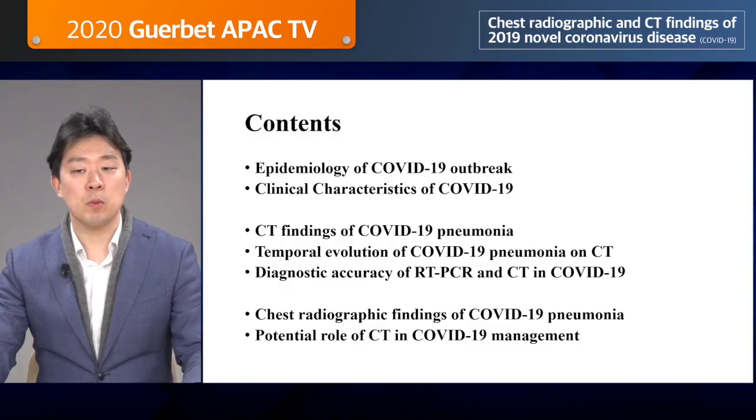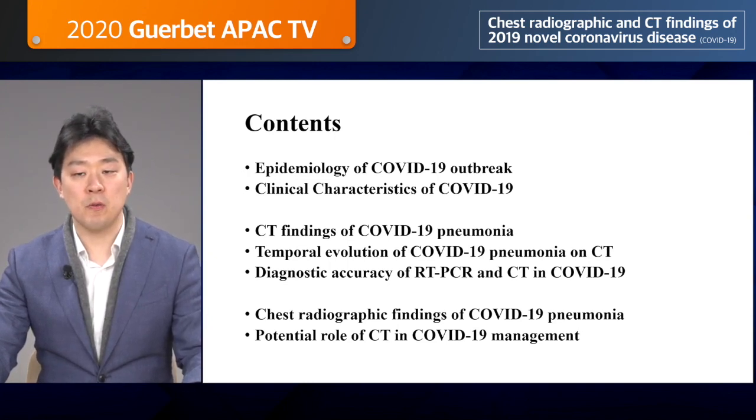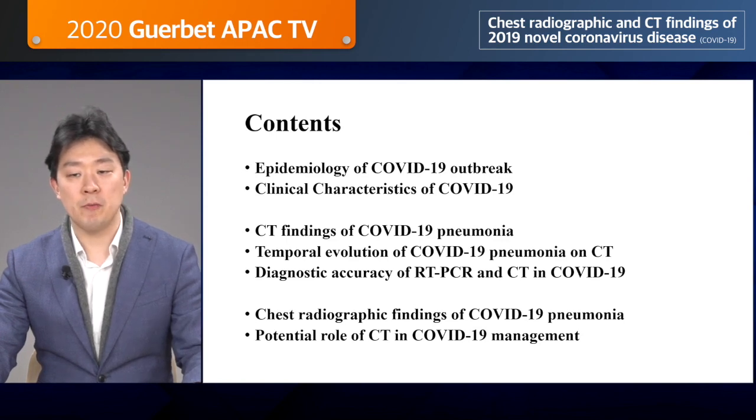Today, I am going to talk about the epidemiology of COVID-19, clinical characteristics, CT findings, changes of the CT findings over time, whether or not chest CT scan can be used as a screening or diagnostic tool, X-ray findings, and finally, the role we expect CT to have.